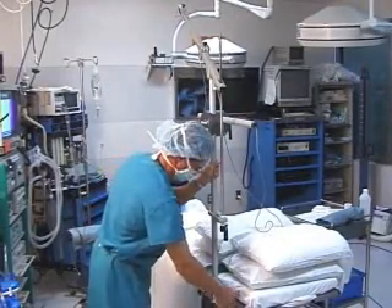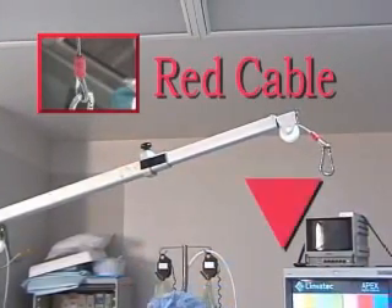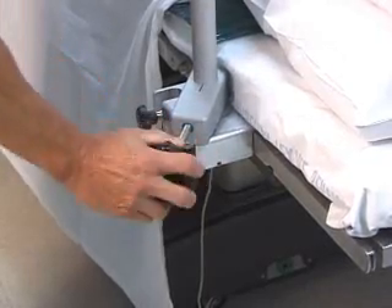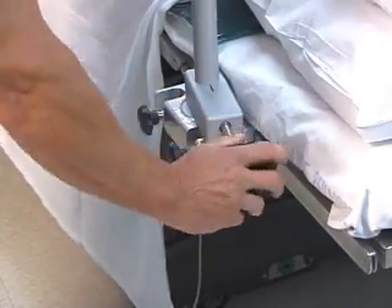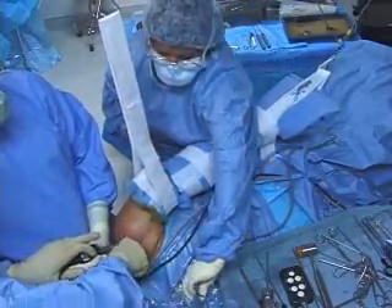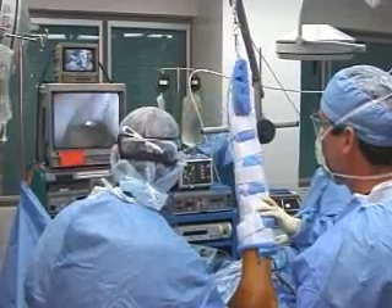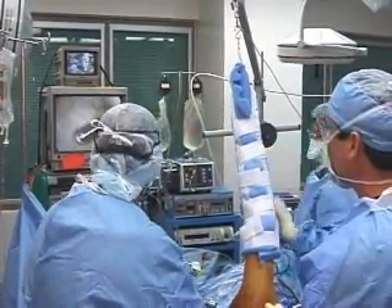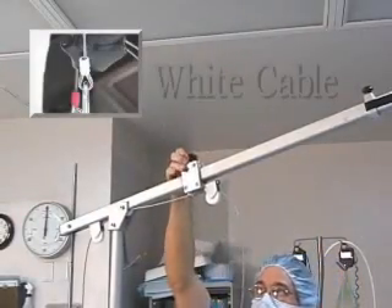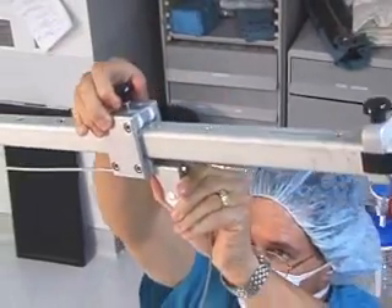Once the patient is positioned, the upper boom of the three-point traction system is properly extended and rotated so that the end pulley at the red cable end is positioned directly over the head of the humerus. The rotational control is released and locked down by loosening and tightening the black knob at the base of the device. This positioning is especially important for procedures where lateral humeral traction and rotational control of the humerus is desired. The pulley is extended by releasing the black knob at the top end of the upper boom. The traveling pulley is attached to the white cable and is adjusted by lifting the black knob and positioning the pulley for the proper abduction.